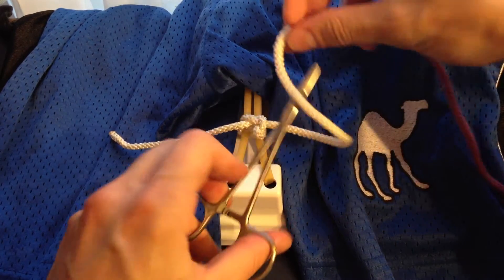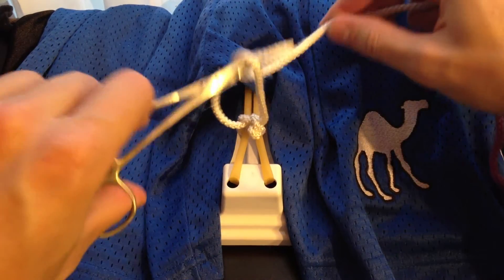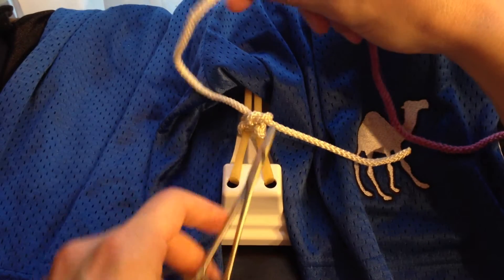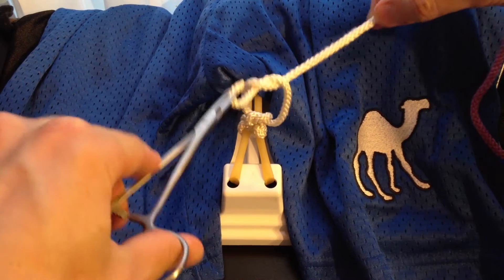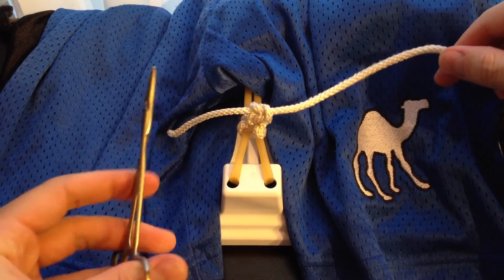Lay it right on top, loop it once, grab the free end, and pull it through — tighten by pulling it in the opposite direction. Lay it on top, loop it once, grab the free end, tighten it by pulling in the opposite direction. And there we go — we've got a second square knot.